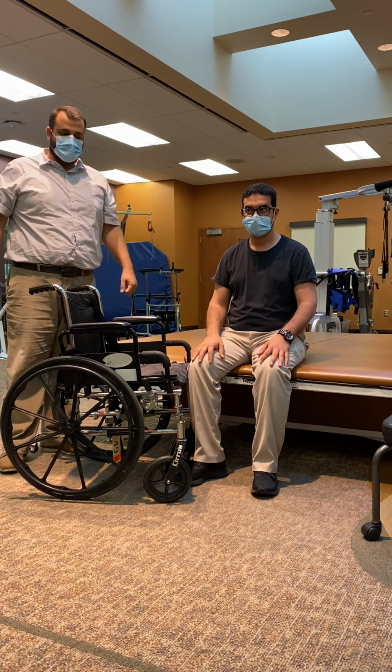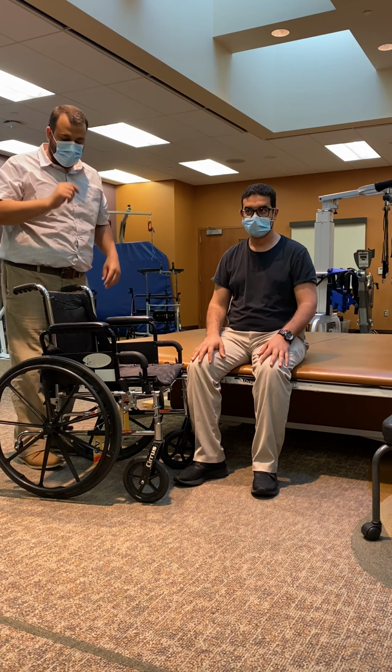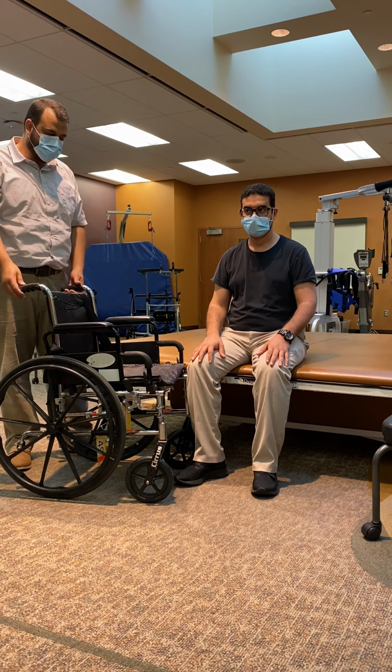This transfer has three main components that need to be managed. First one, the surface that the patient is moving to, which is the wheelchair. Second one, the patient himself. Third one is the therapist, because you need to manage your position to be in the correct position and not to hurt your back or hurt yourself as you transfer.